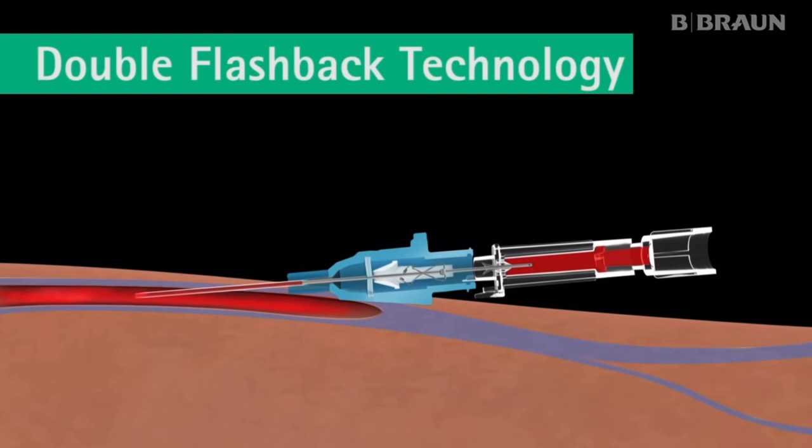Once the catheter is advanced completely, the needle is withdrawn straight out of the hub.